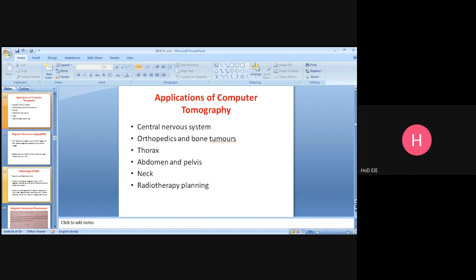And also finding your lung lesions as well as mediastinal tumors. It also differentiates between malignant and chronic pulmonary inflammatory lesions. So a clear-cut outline will be provided by this CT scan image. Okay, and additionally it also provides evaluation of any enlargement, that is the mass of lymph nodal enlargement, or else mass lesions that are mainly present in the mediastinum or the hilar region.